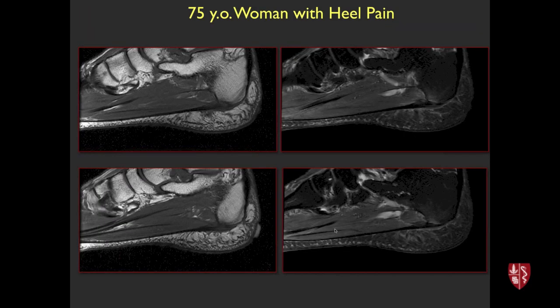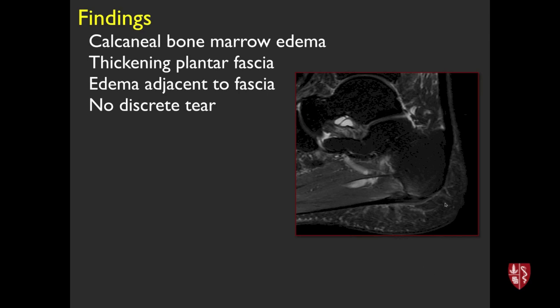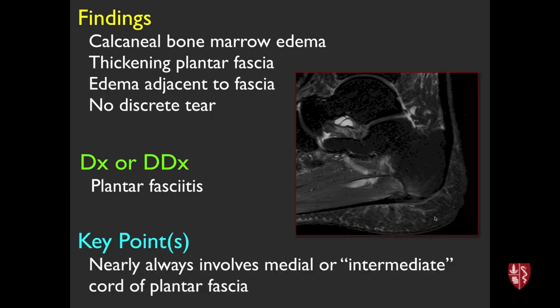75-year-old woman with heel pain. There's bone marrow edema in the calcaneus, thickening of the plantar fascia, and edema adjacent to the fascia without a discrete tear — plantar fasciitis. This almost always involves the medial or intermediate cord of the plantar fascia rather than the lateral, and tends to be proximal. Commonly associated with a little reactive bone marrow edema.